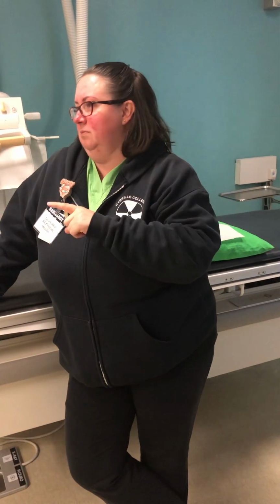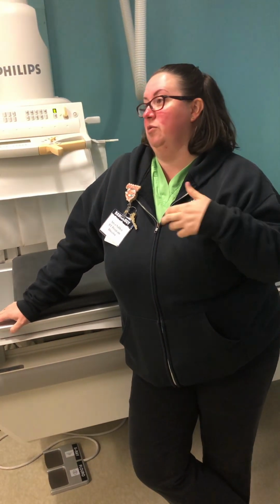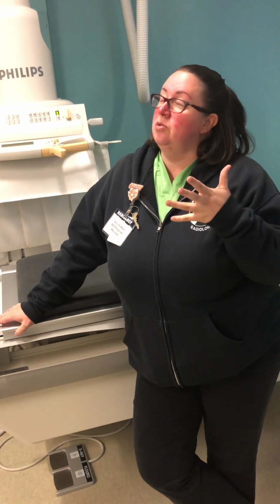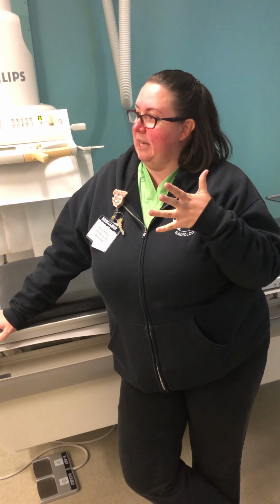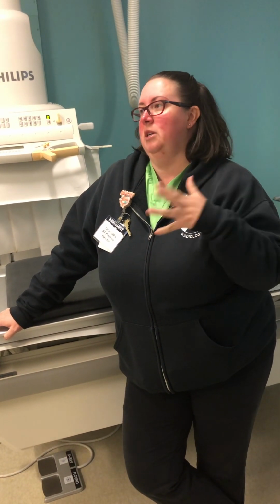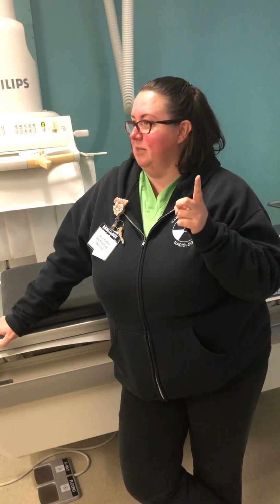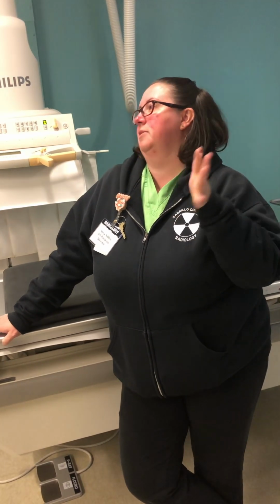So 72 for the lateral, and then you can, but you don't have to, bring it in to 40 for the RAO, right? Sometimes we like to use that purposeful magnification to help some of the details of the sternum become visible, especially when we're also trying to blur out ribs and other fun things. Like I said, in this case, it's easier to start at 72 with the lateral, and then go into 40 when you go to do the RAO.